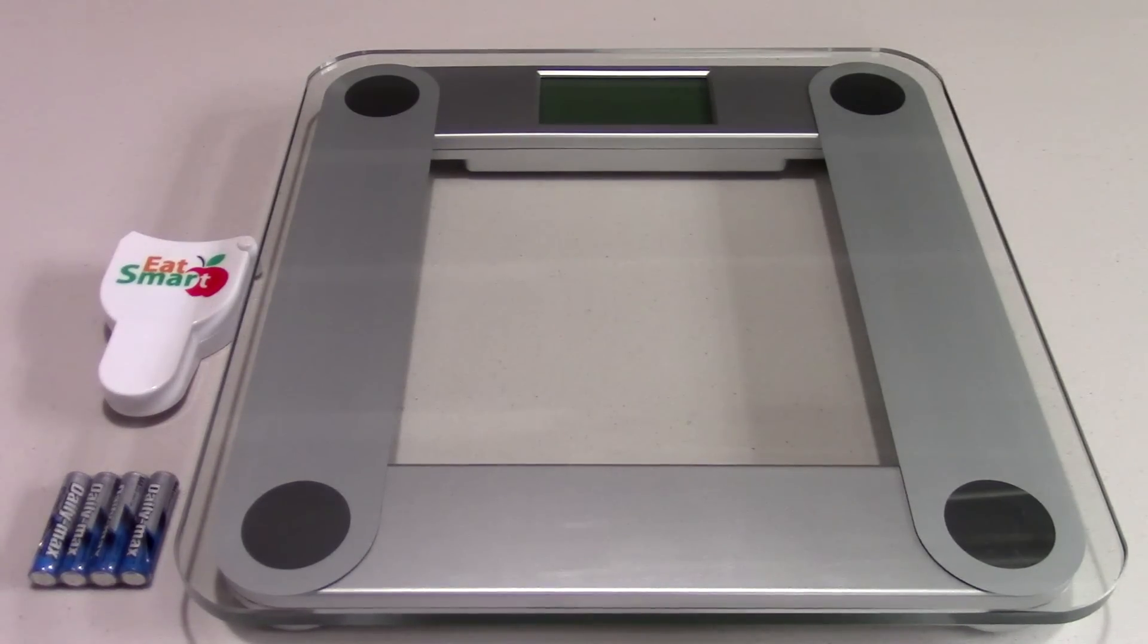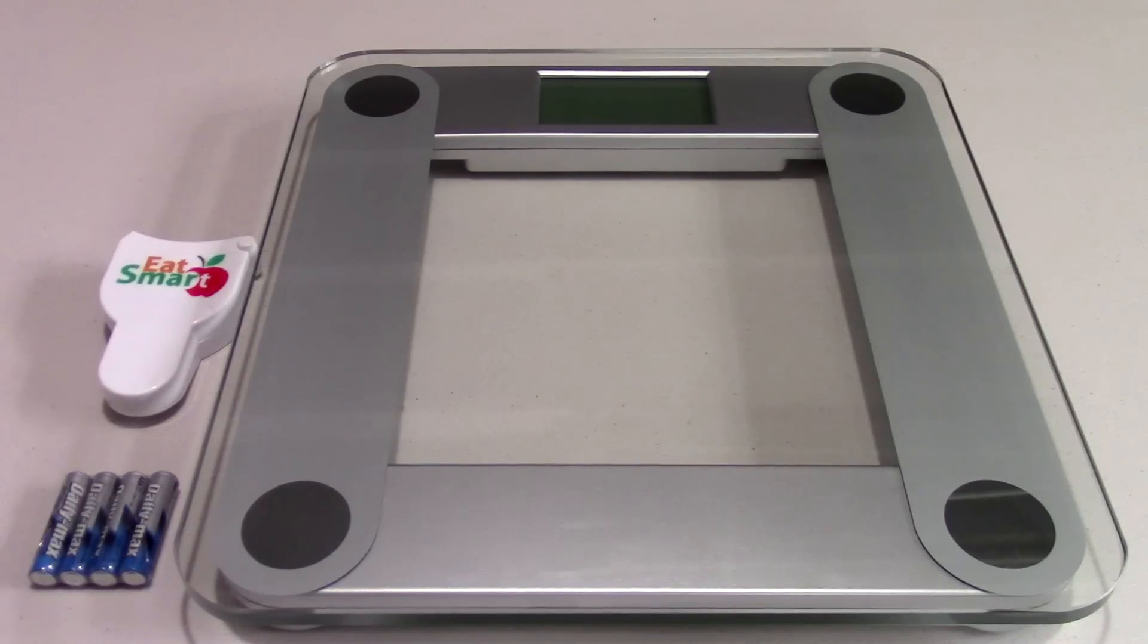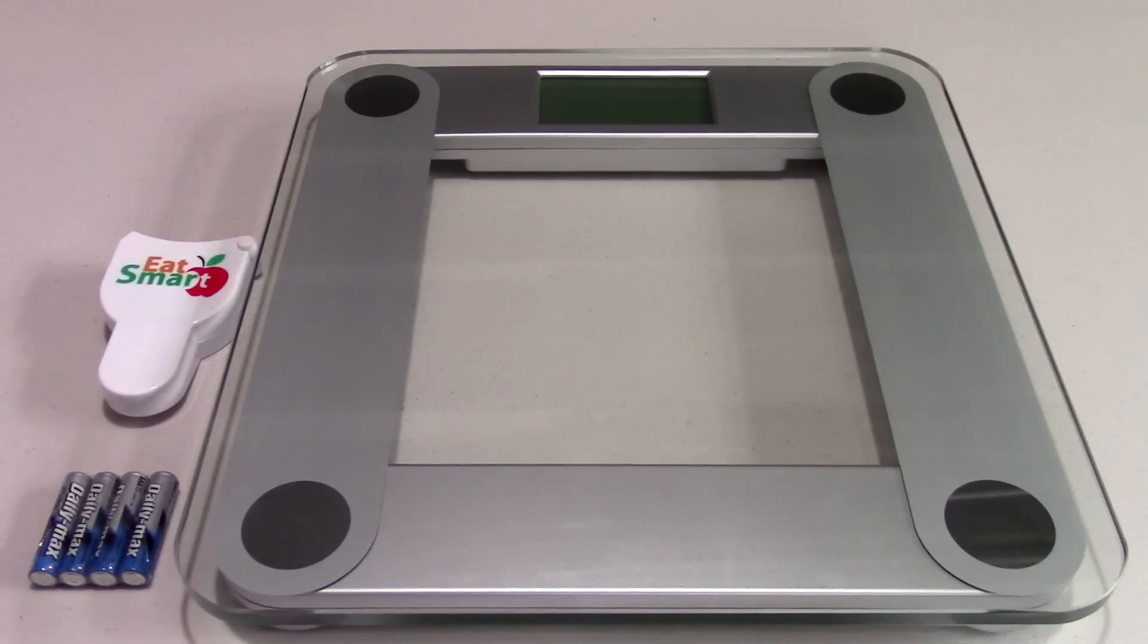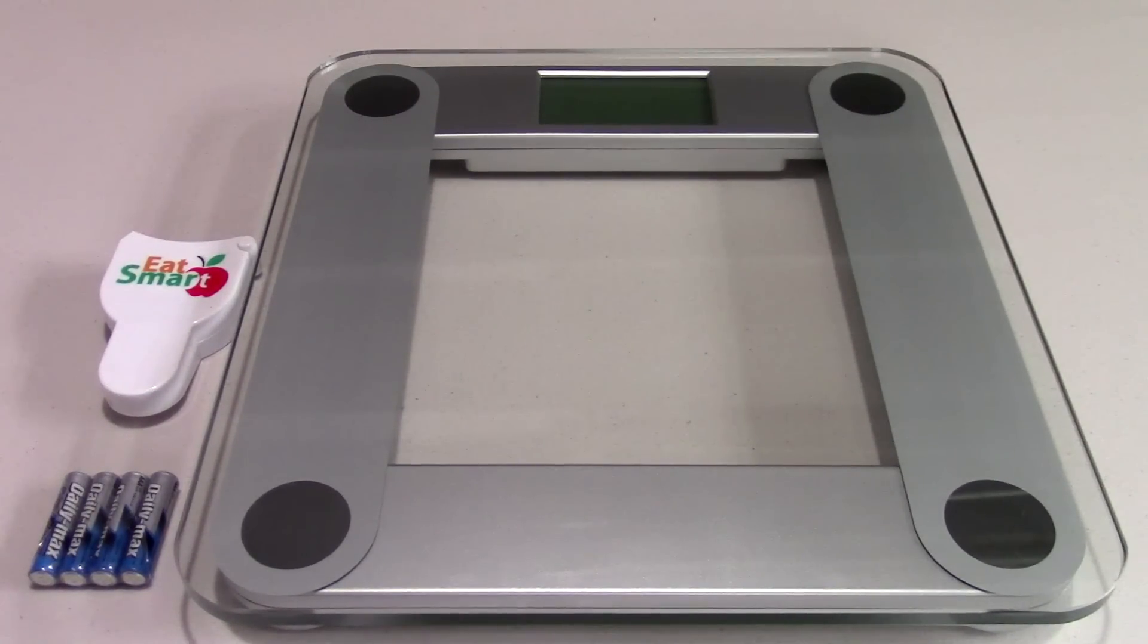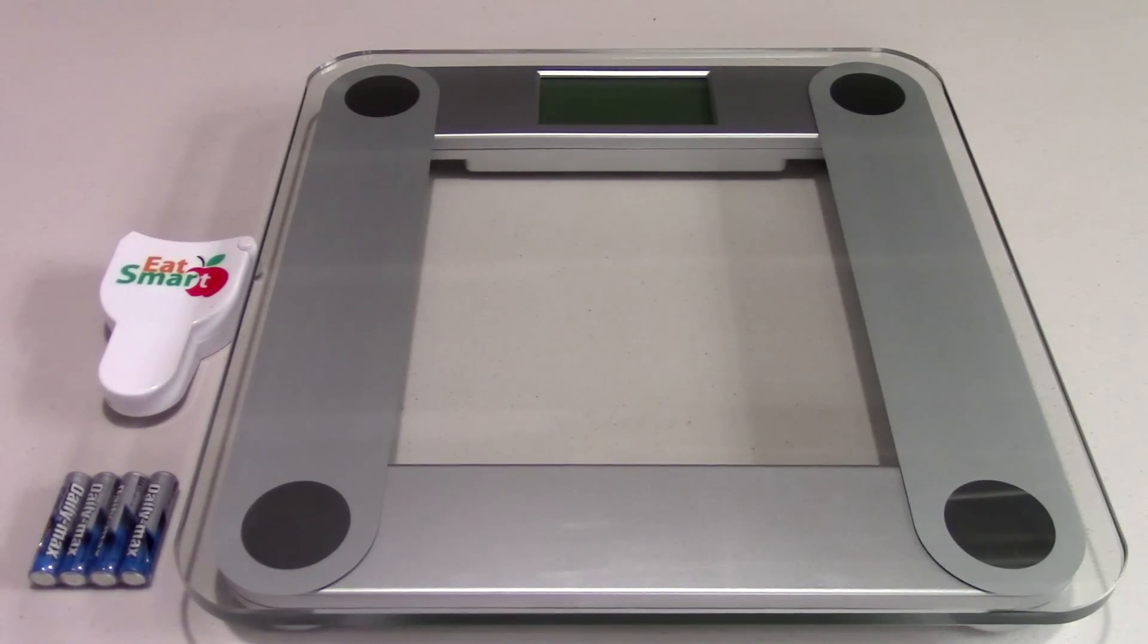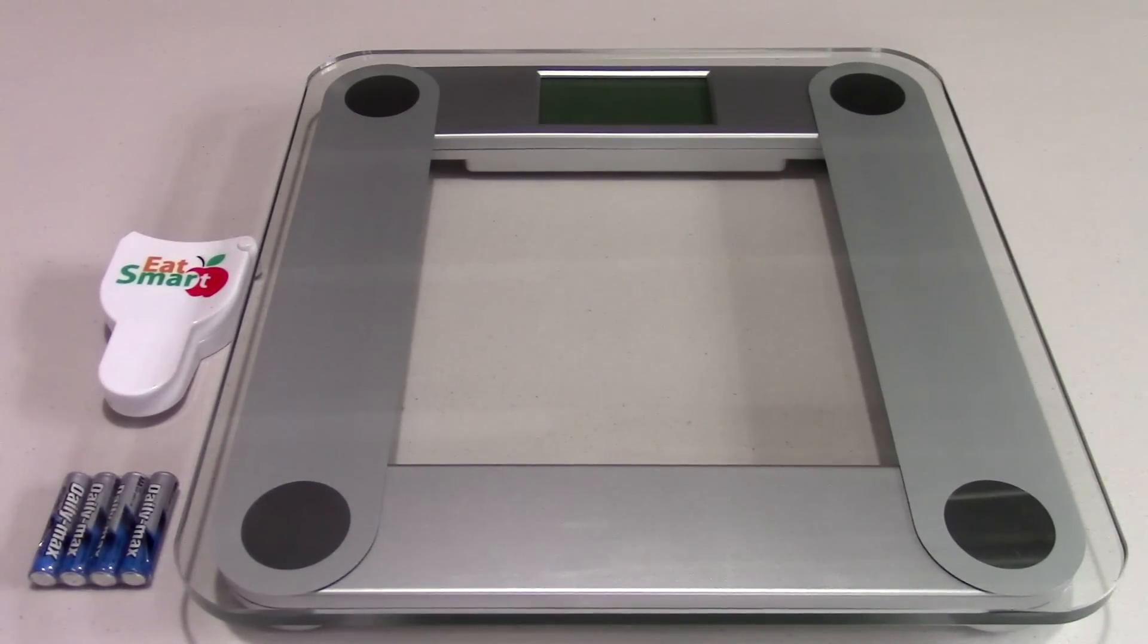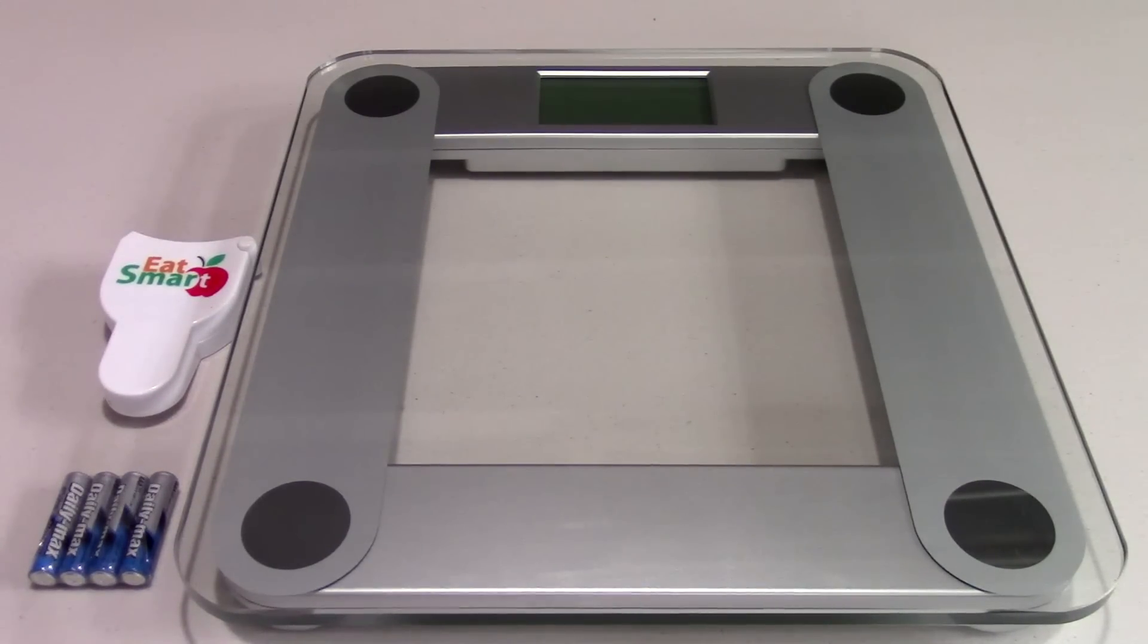What we have here is the EatSmart Digital Bathroom Scale, model number ESBS-01. This scale is the number one rated bathroom scale on Amazon, and pretty much any household that has multiple bathrooms, it's nice to have a scale on each one or one for the kids and one for the adults.